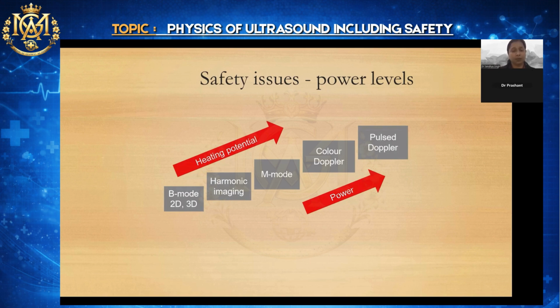So that is why in the first trimester, please, this is a very important take-home message. Next take-home message for everybody: don't use pulse wave Doppler to measure the cardiac activity. Like for documentation, what we do? We use pulse wave, we measure the heart rate in the first trimester for dating. Don't do that. You can do that by M mode. It's pretty simple. Use M mode. Or you can just take a clip of that.